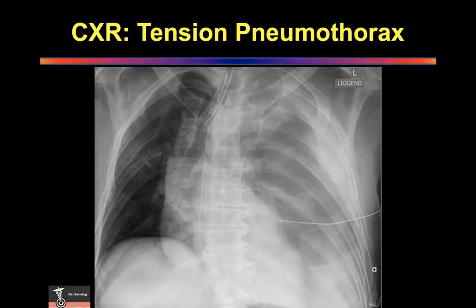This is the problem. So in the exam, we ask you this question. Very often I ask you that what is wrong with this chest X-ray? And if you say all the findings, but you don't tell me that really tension pneumothorax is a clinical diagnosis and the tube should be put in even before you do a chest X-ray. You understand that? That's how you score in the exam, by telling me extra points.